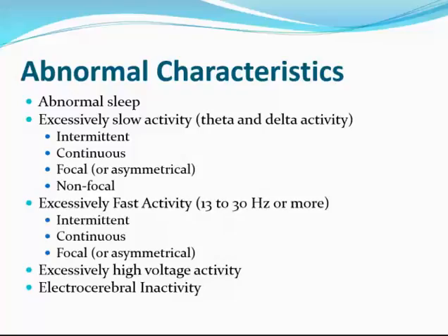As we continue, in this slide, abnormal sleep patterns. You start to see things that you're not supposed to see in stage 1 of sleep. That's abnormality. Or another stage, or things just mingled together that you don't expect to see in a stage 4 sleep, in a stage 3, in REM sleep, all kinds of things.